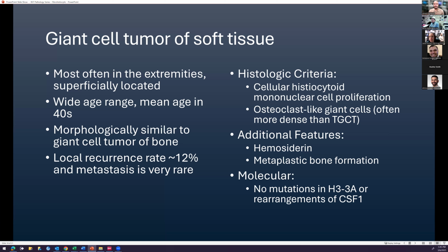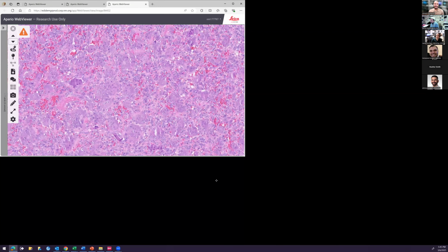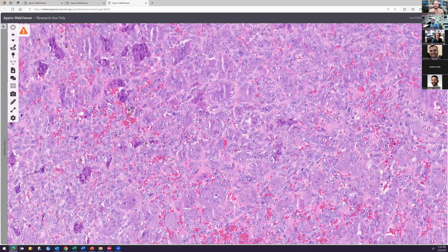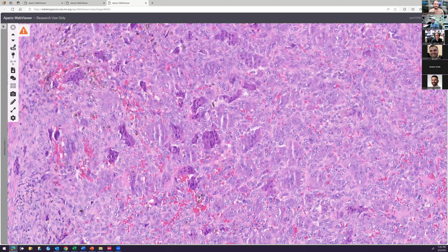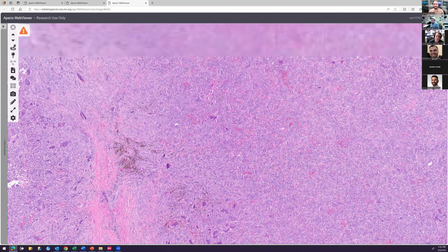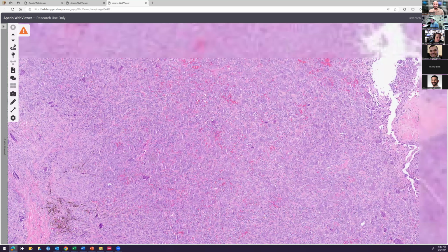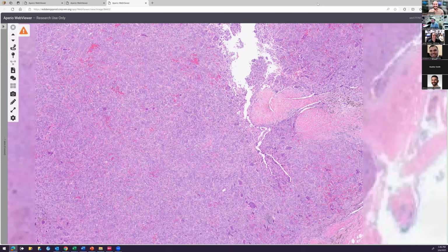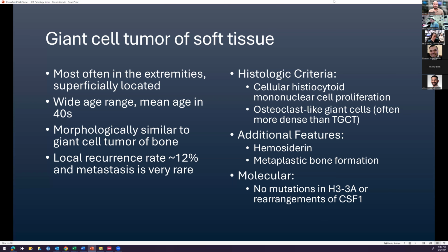Yeah, but the degree of bloodiness in this last specimen, I feel like didn't really match the degree of hemosiderin-laden macrophages, and that makes me feel some sort of way. Trying to blood shame this tumor? Yeah, I think so. But it's got plenty of blood, that's true. I mean, it will have hemosiderin, right? But it takes time for the blood products to turn into hemosiderin. So you'll see kind of mixed pictures of both. Some of it obviously could be procedural, if you're trying to blame the surgeon for a bloody mess. That can also be the case. Okay, thanks. That's true.